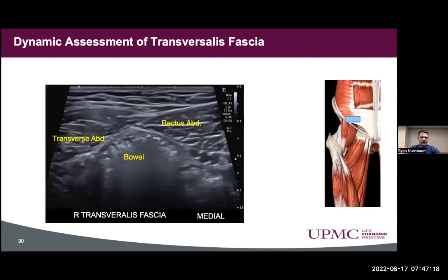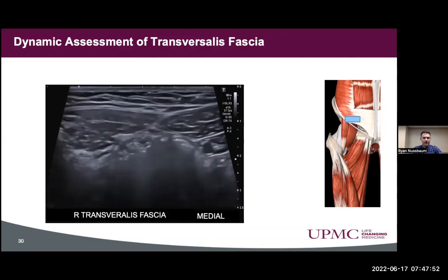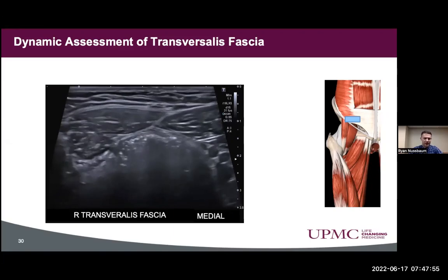Next we looked at the transversalis fascia to see if there may be a disruption. We wanted to find the transverse abdominis. For any type of hernias, it's a good idea to do this both in supine and standing, since standing may reproduce symptoms more frequently due to gravity. Having the patient bear down, we weren't really seeing any sort of disruption of that aponeurosis. There was no large defect or fat visualized in this region with Valsalva maneuver.